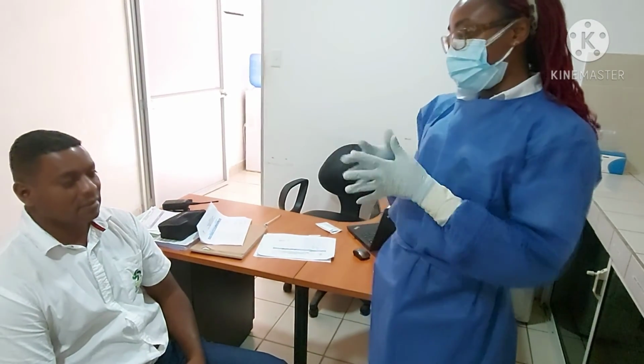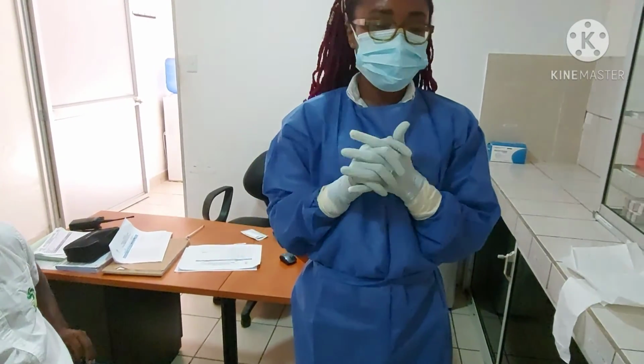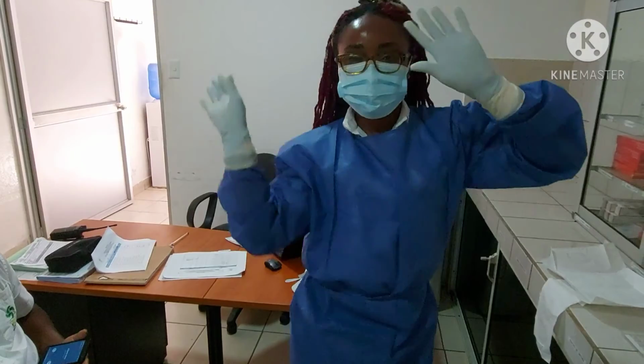At this point, I'm asking the patient how the process was for him. He said it was uncomfortable but not painful. He had the feeling of sneezing, and it was very uncomfortable for him. Now I'm asking him if he prefers the nasal swab or the blood sample from the finger, and he obviously prefers taking the blood sample from the finger. So we're still waiting for the results. In 15 minutes we're going to be interpreting the results.